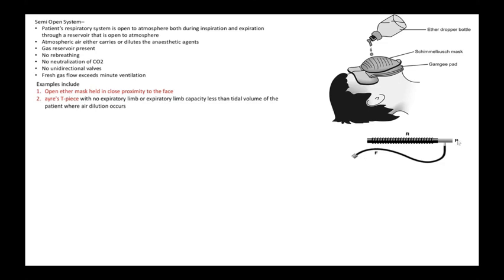So the fresh gas flow is delivered here. So the apparatus dead space is very small. So remember the 2 points that the apparatus dead space of a breathing circuit is determined by two things. One is it should be from the point of entry of fresh gas flow. So this portion, for example, if you put a mask or an endotracheal tube, and the volume of that plus the volume of the T-piece up to this point is the apparatus dead space.